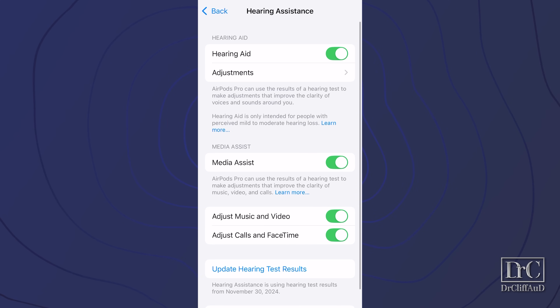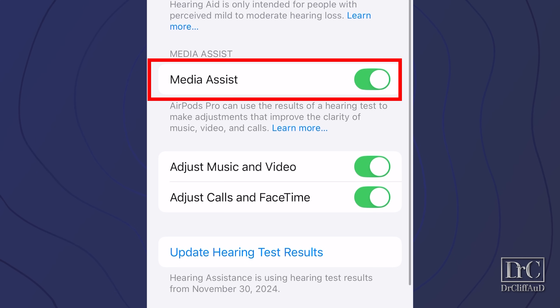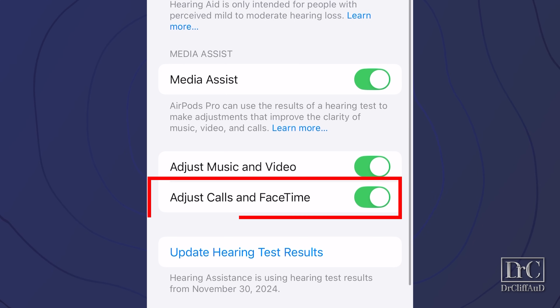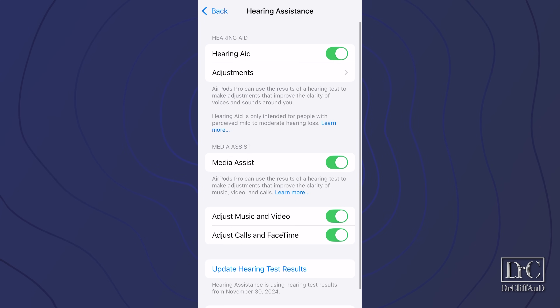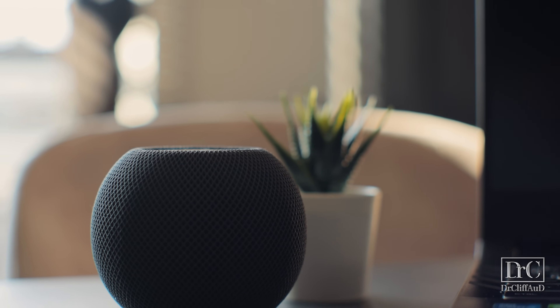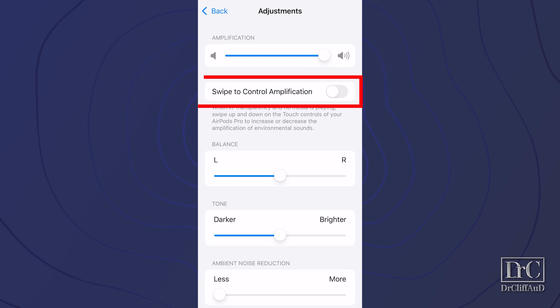Once you have the test entered in the hearing assistance screen, you can toggle the hearing aid feature on. On the same screen, you can toggle on or off media assist — entirely or separately for music and video audio, and calls and FaceTime — which applies your hearing test results to different types of streaming media. If you want to customize the audio further, click on adjustments. I recommend turning on the TV or playing some external audio so you can customize each adjustment to your preference. In this section, you can control your level of amplification from mute on the far left to maximum volume on the far right. The swipe-to-control amplification feature allows you to adjust the volume levels of the hearing aid feature when you're in transparency mode and not streaming other audio.